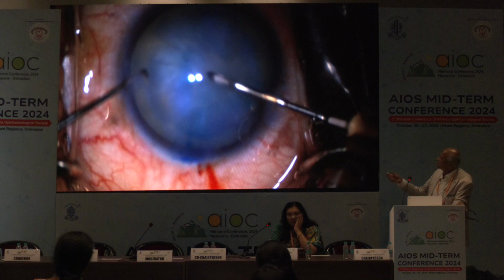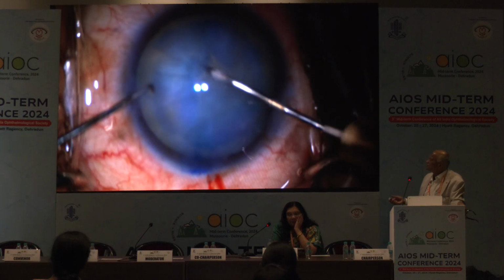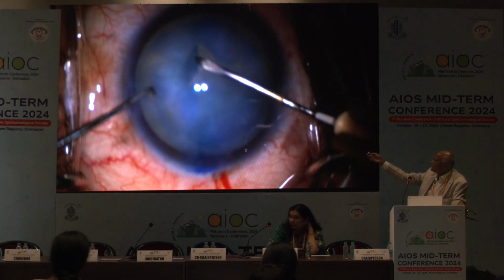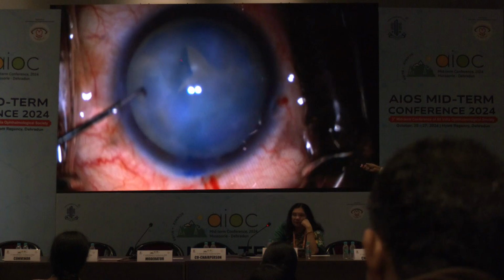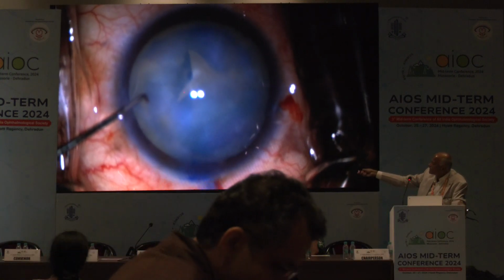Now see, this is all fibrous area. I am doing it, and this, can you see this? Can you see what is happening? Can you see this? Here you see, I have torn here, and now you see what is going to happen.